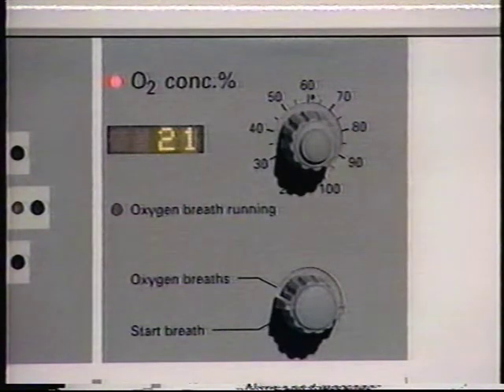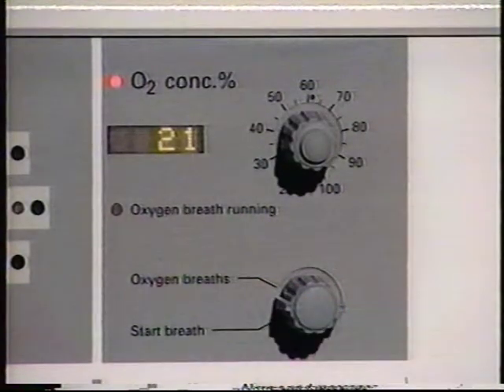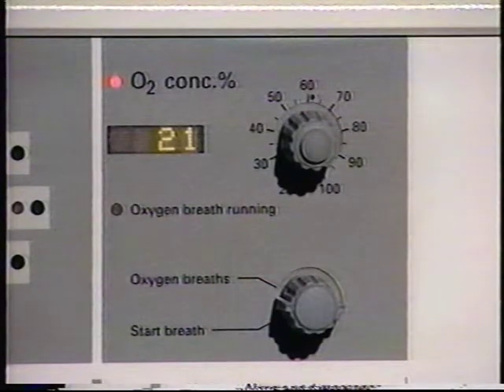If you switch this knob from neutral to start breath, a manual breath is delivered according to the values you have set. If you are in one of the SIMV modes, moving the knob to start breath activates a mandatory breath. When you do this, make sure the patient has enough time for expiration between breaths.